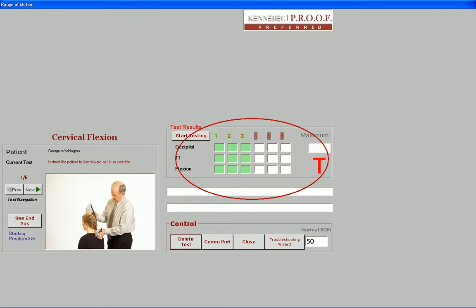A couple of things worth mentioning regarding range of motion tests. The AMA requires that a set of three consecutive tests be performed by the patient. The results are required to fall within a predetermined range of one another. As you are taking your patient's measurements for each test, the software automatically keeps track of the validity of the test, as well as the number of tests remaining to meet the AMA requirements.